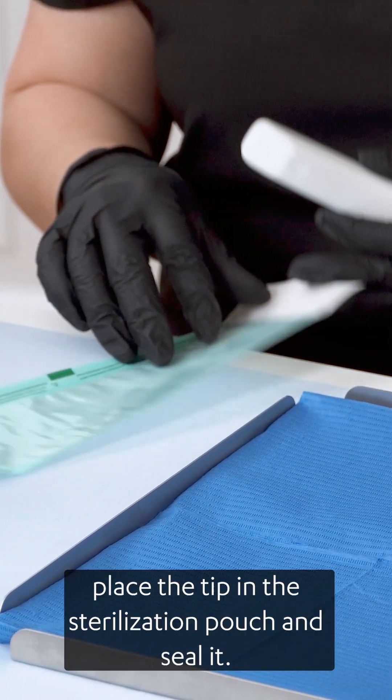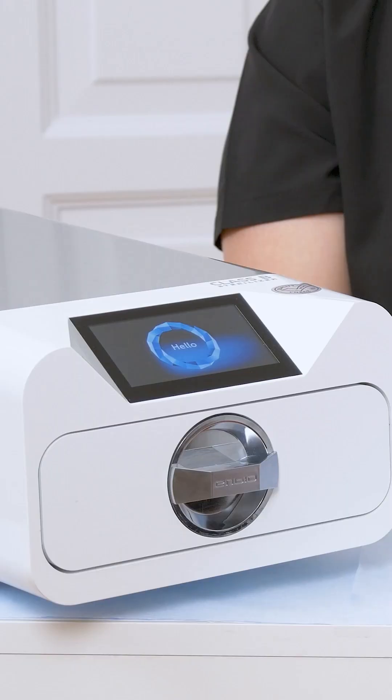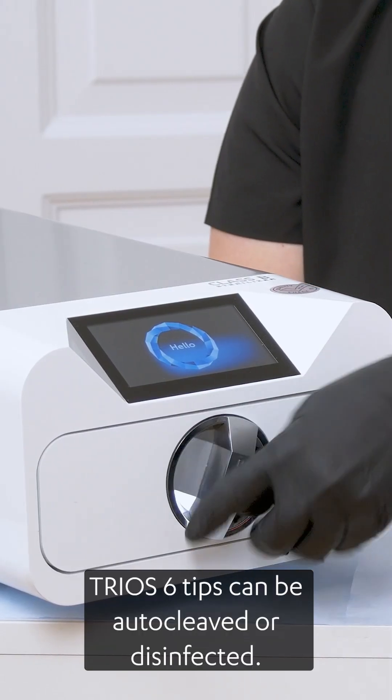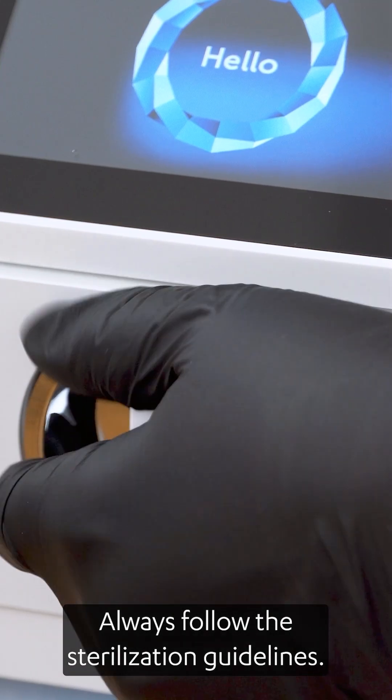Once clean and dry, place the tip in a sterilization pouch and seal it. TRIOS 6 tips can be autoclaved or disinfected. Always follow the sterilization guidelines.